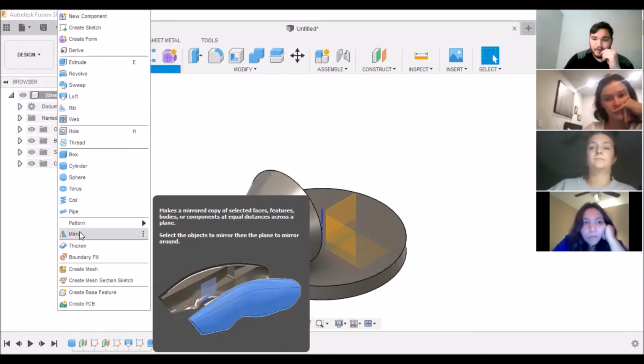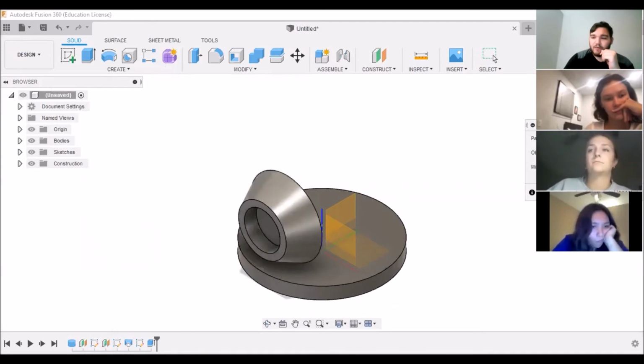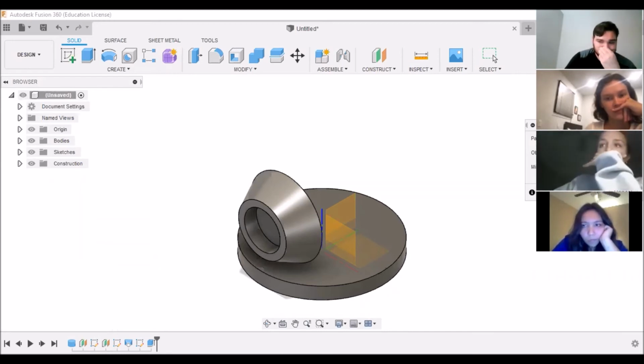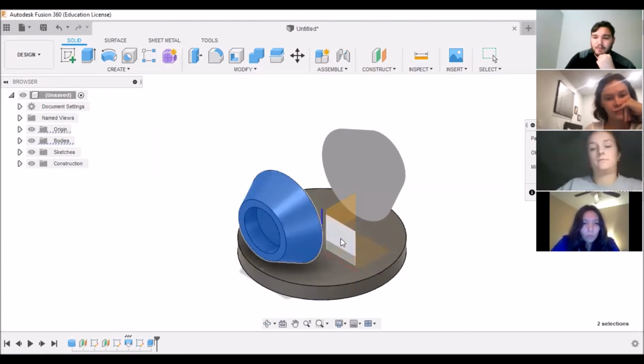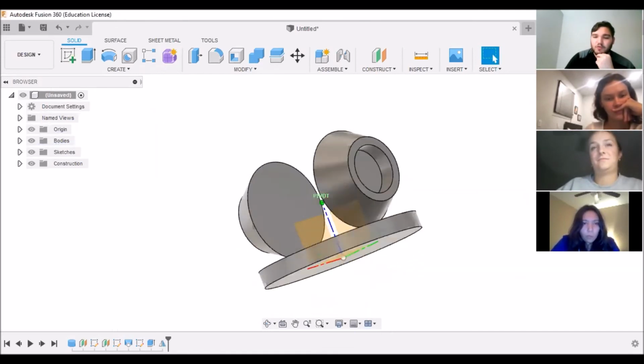If we click on mirror, we now have a new drop-down where it says faces. Normally you don't really want to work with faces, especially in this instance, so we need to change that to bodies. Once we change it to bodies, we can highlight the new cap that we made. We can select mirror plane and just do it over the middle axis plane that we had originally offset it from. You can press OK, and now you have dual caps.